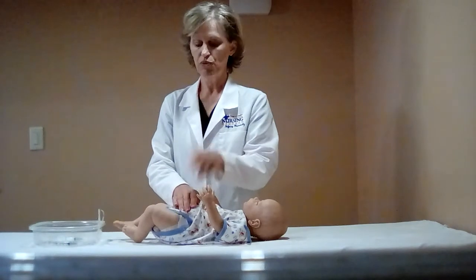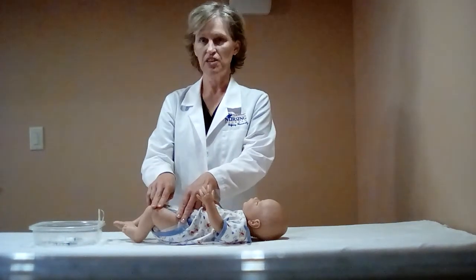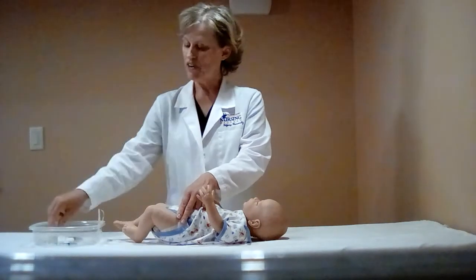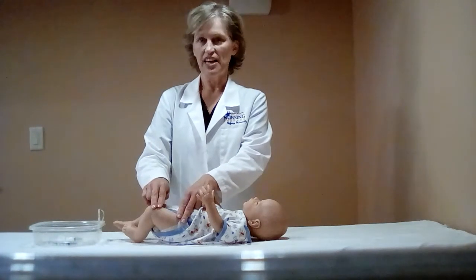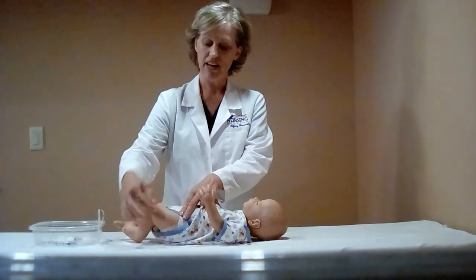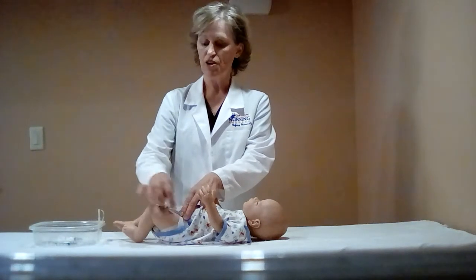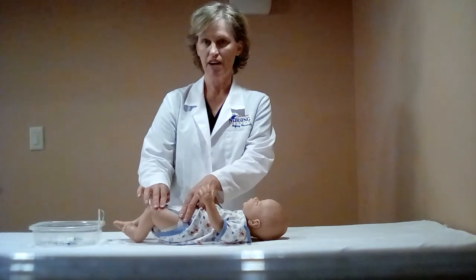You're going to place 2 fingers along the upper edge of the thigh and 2 fingers above the knee. This will expose the middle thigh. Then you give the injection at the anterolateral position. Anterior is the top of the thigh, lateral is the side of the thigh, the anterolateral is in the middle. When you think you have the correct position, just point to it and I'll confirm that you are correct.